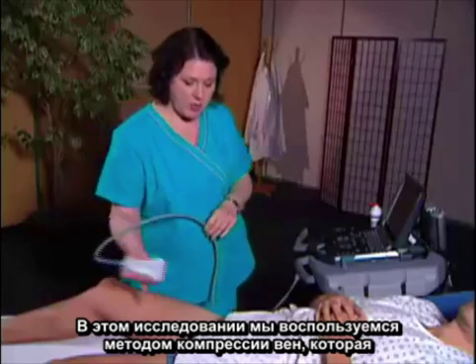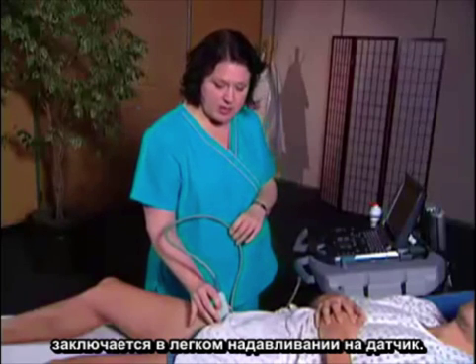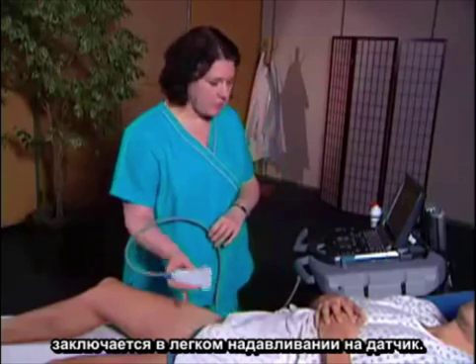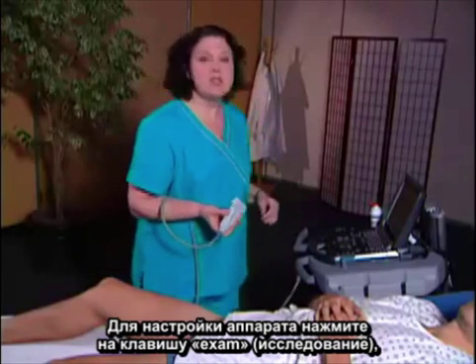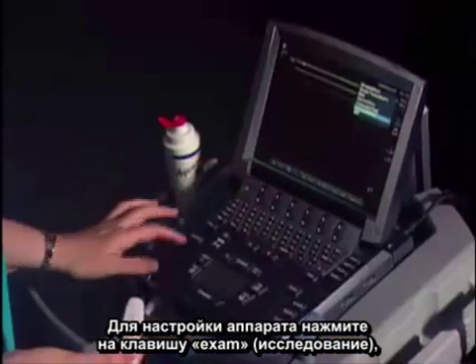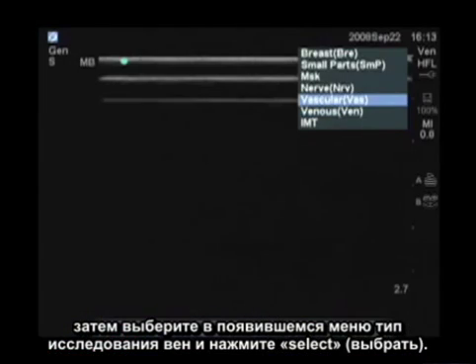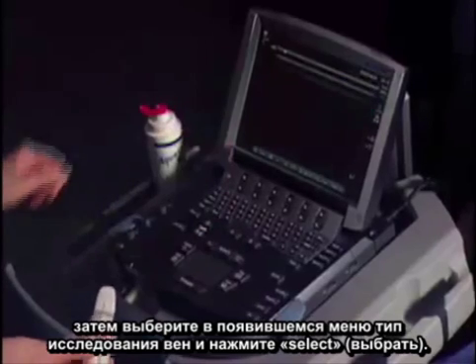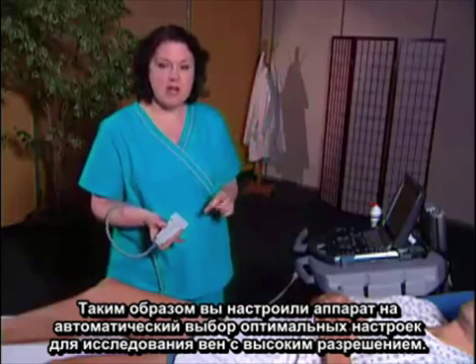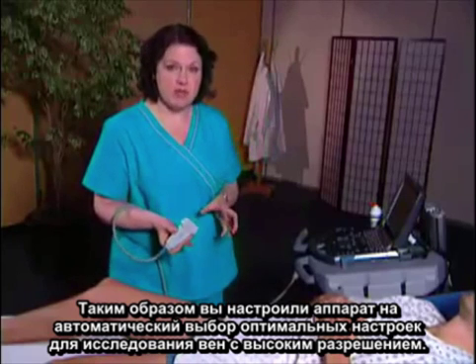For this examination technique, we're going to use a compression technique where we just slightly compress the vein with some downward motion. When you set up the exam on the system, select the exam key, then from your menu select the venous exam type and hit select. This optimizes the system so it's automatically configured for your best resolution of the veins.